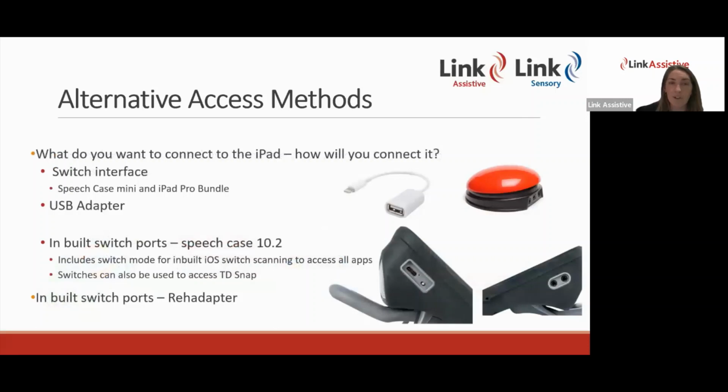And if you're going to add those solutions, you just need to think about how it's going to connect to the iPad or the case as well. So do you need an interface or an adapter that the access method solution can connect to, or can you plug directly into the case through the switch ports if you're using a switch?